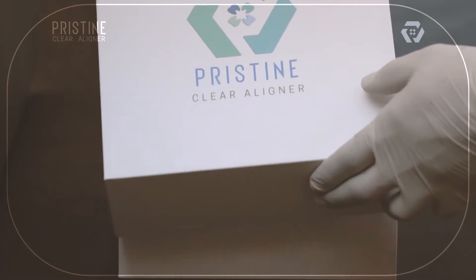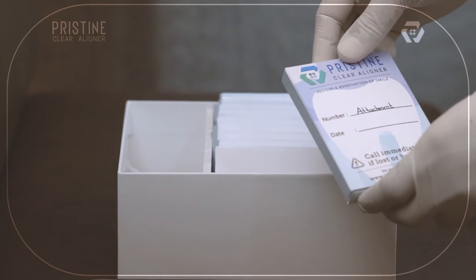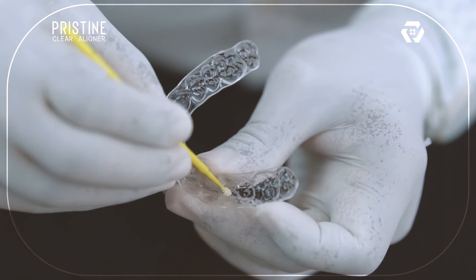Pristine provides two types of attachment templates: made of hard sheet and soft sheet. For the hard sheet template, apply a thin layer of vaseline to the template — this will prevent the composite from sticking to it. Composite won't stick to the soft template, so no need to apply vaseline. However, adaptation will be poor with the soft template, so be very careful before curing it.